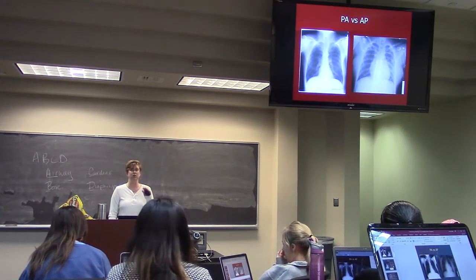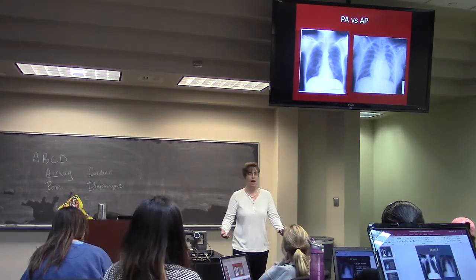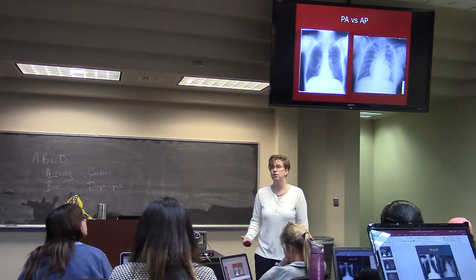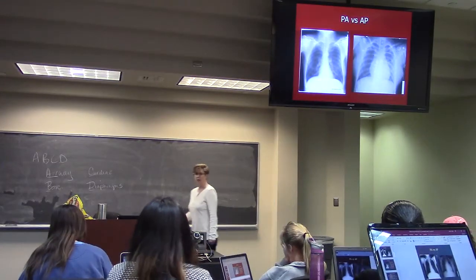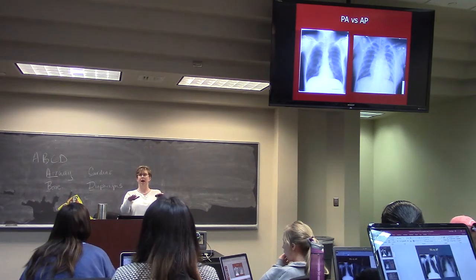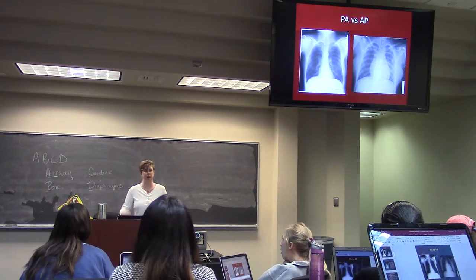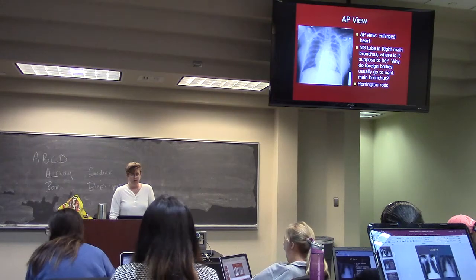Your x-ray's always looking at you. So it's like the patient is looking at me when I put an x-ray up. They're always facing you. And I think Dr. McNeil probably said that to you, right? They're looking at you. Even a CT, it's like they're laying and they're looking at you, down at their toes. They're laying flat. That's how the slices should be placed. Okay?